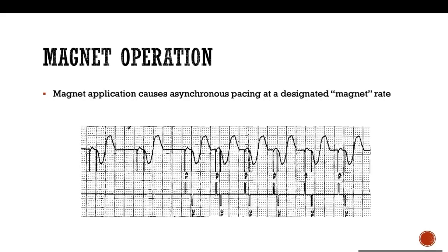So if you're transferring patients from one place to another, or if you're doing some changes in the OR, for example, ortho surgery or things like that, you're not 100% sure that the magnet is going to stay in place. But that will give you time to get the programmer, or if you have a programmer and the cases are not urgent, you could actually do that.